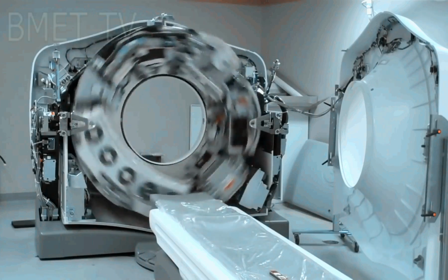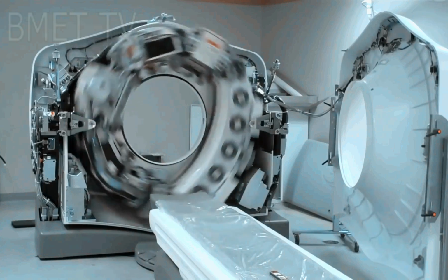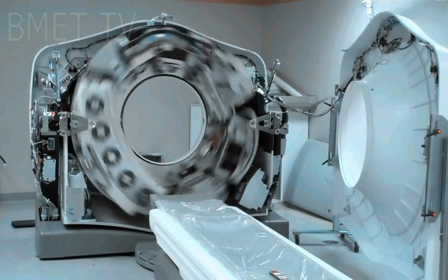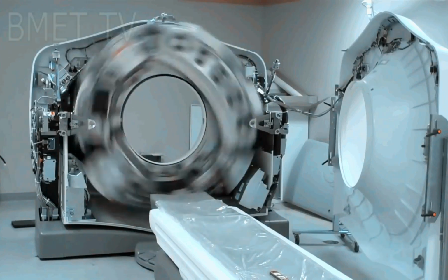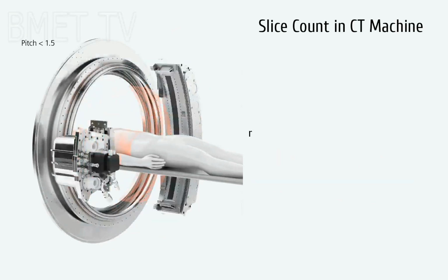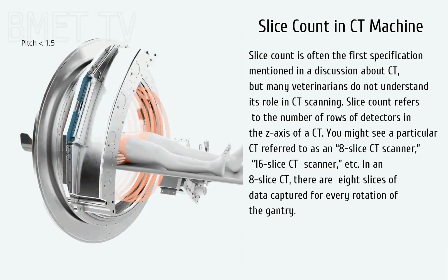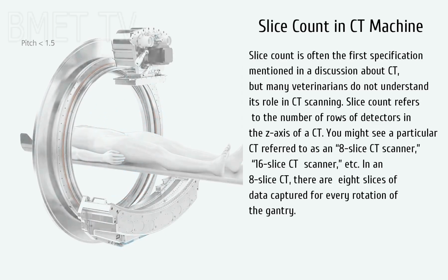16-slice CT machines can perform a wide variety of sophisticated and complex imaging procedures. It provides full organ coverage with high-resolution imaging, but is not considered adequate for detailed cardiac analysis such as coronary vessel analysis. 32 to 40 slice CT machines generally feature shorter examination times than the 16-slice, with reduced likelihood of motion artifacts.